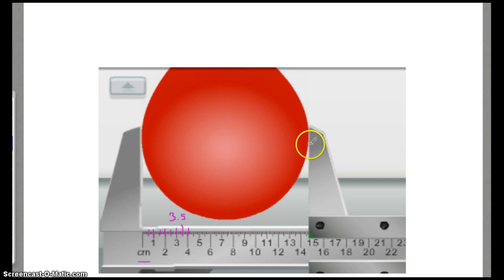So, all right, here's how far apart the calipers are, and we're going to measure that distance down here, right where that little green arrow is. So it's right there. And if it was right here, it would be 14. 15 would be over there. So we know it's between 14 and 15.